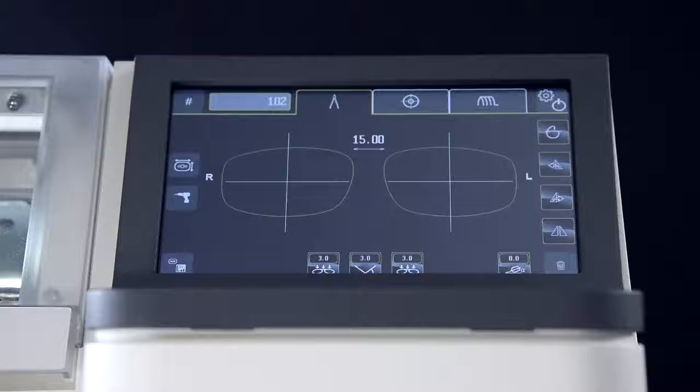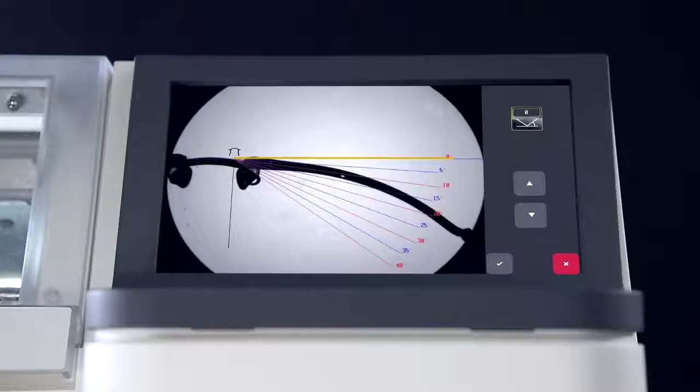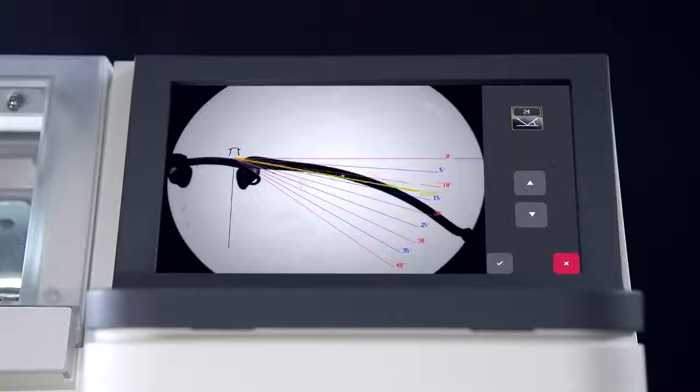This measurement is independent of the base curve of the demo lens. By knowing the base curve, we will be able to reproduce the real 3D data of the demo lens. Therefore, we included the capability to measure the demo lens base curve, making Gravitek the first and only demo lens 3D tracing solution available.